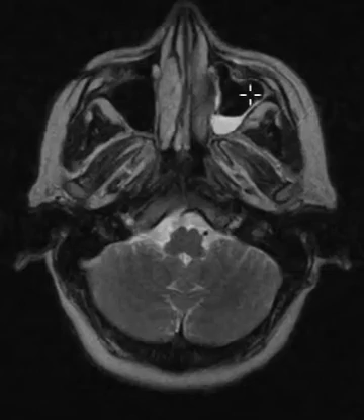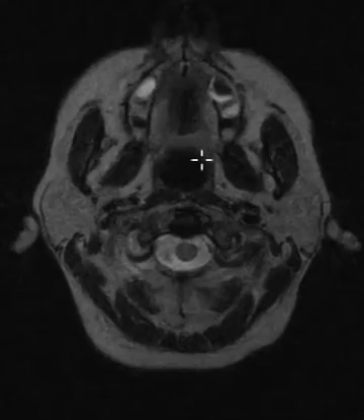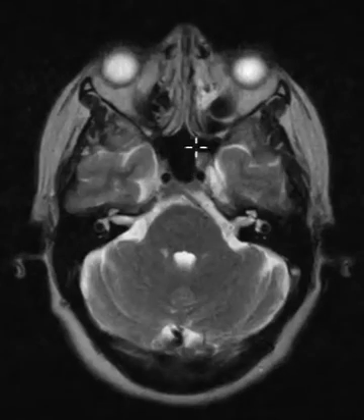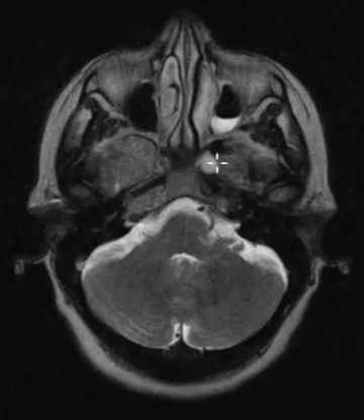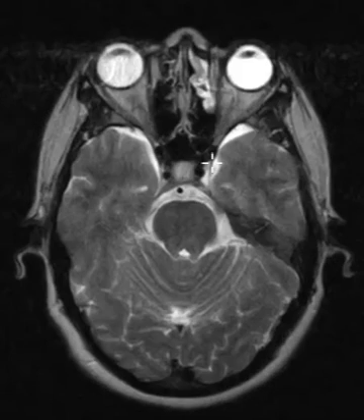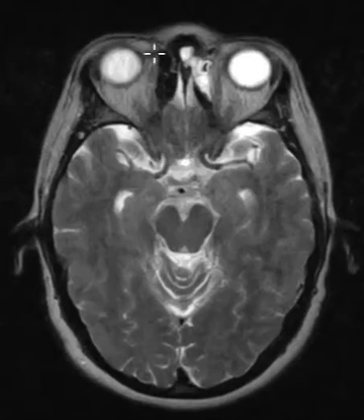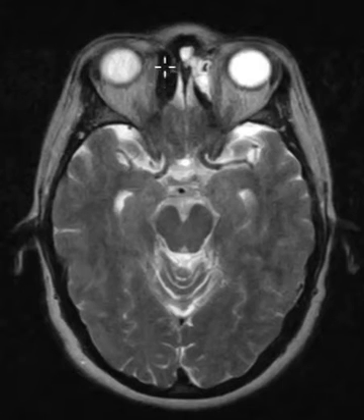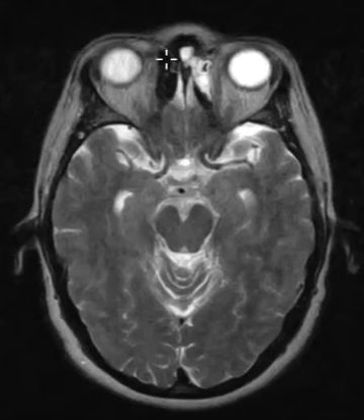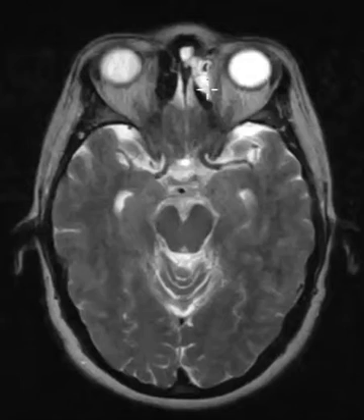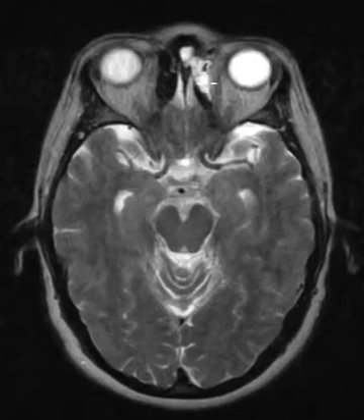This is the maxillary sinus, but there are other sinuses. One back here is the sphenoid sinus — it looks pretty good, just a little area on the left. This is called the ethmoid sinus, between the eyes. The right ethmoid sinus looks good with darkness indicating air. On the left side things are very bright — that's mucosal thickening in the ethmoid sinus.